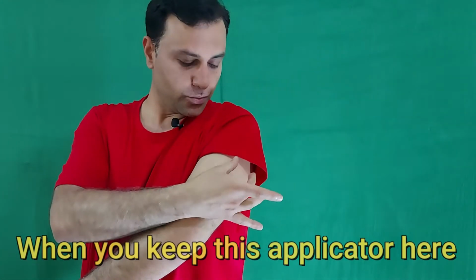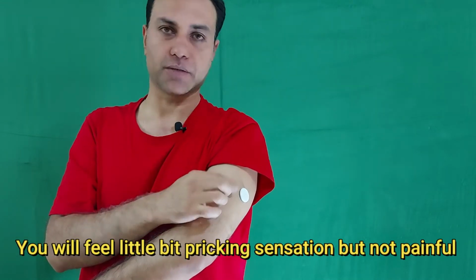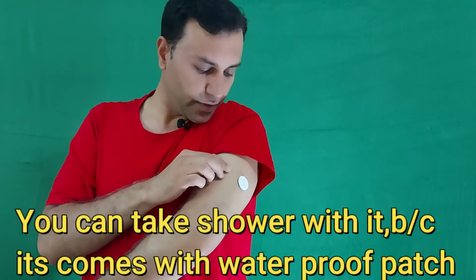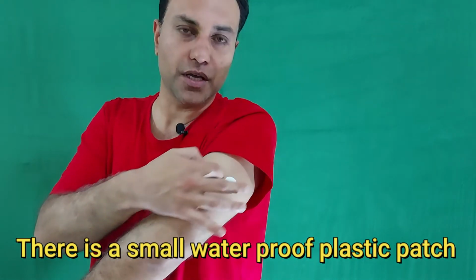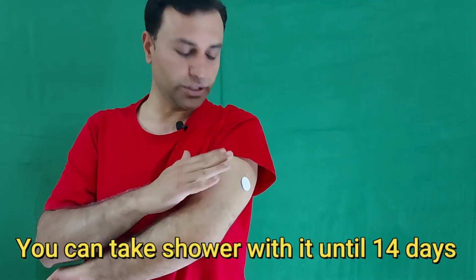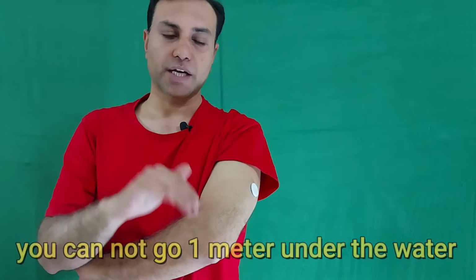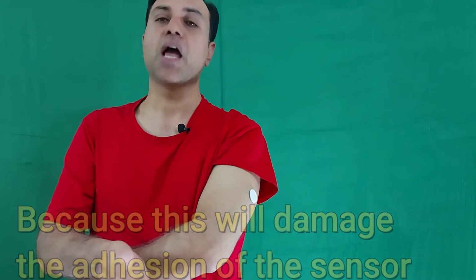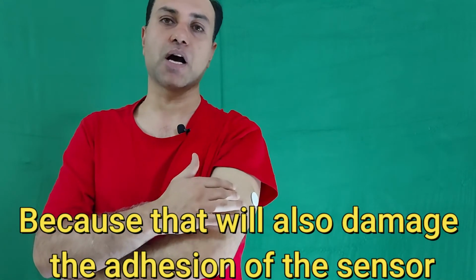As I told you before, when you keep this applicator here and you install it, you will feel a little bit of a pricking sensation but it is not painful, and this is attached to this area, so you can take a shower with it. As I told you, this comes with a waterproof patch down here. As you can see, this will be a small plastic patch. It's waterproof. Actually, you can take a shower with it for up to 14 days. You can swim even with this one, but be careful during swimming. You cannot go below 1 meter of water because this will damage the adhesion of the sensor, and you cannot stay there more than 30 minutes in the water because this will also damage the adhesion of this sensor.